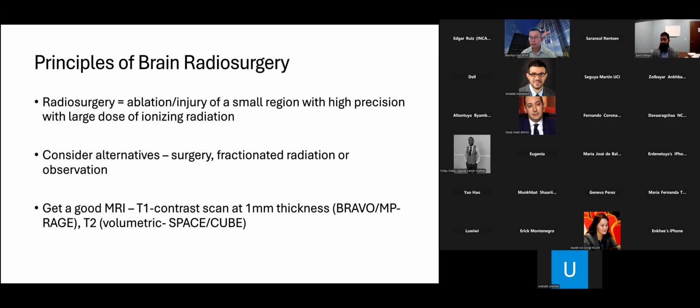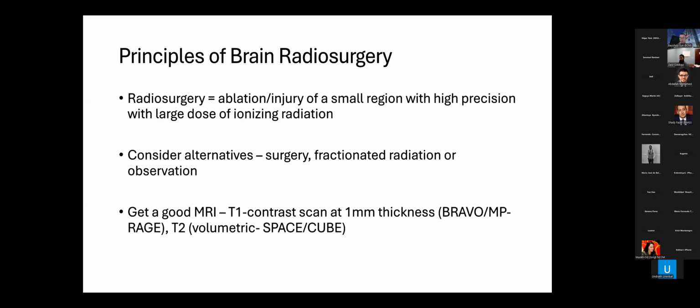You can use other types of T1 post-contrast high-resolution sequence like the SPACE sequence or spoiled gradient sequence, but they don't have quite as sharp a delineation compared to these magnetization preparation sequences, so-called MP. Now, T2 is not as critical for every case, but there are many radiosurgery cases, including benign cases or brain metastases cavity cases, that require T2 for good planning. I think you can get away with a plan with a very good T1 sequence with contrast, but T2 adds an additional element.